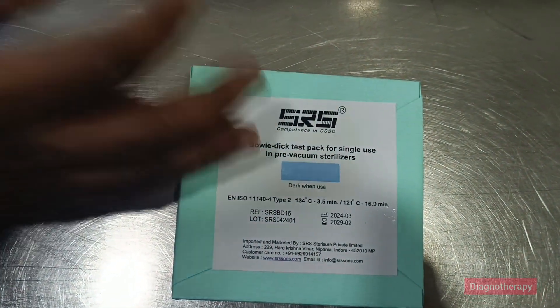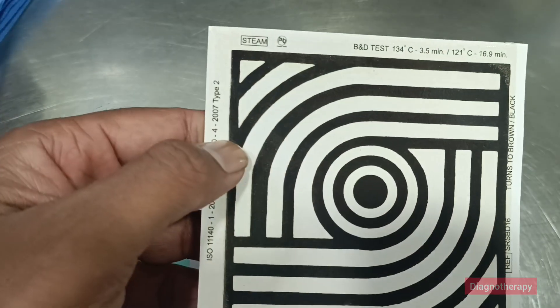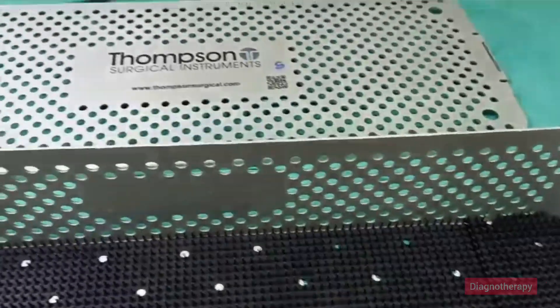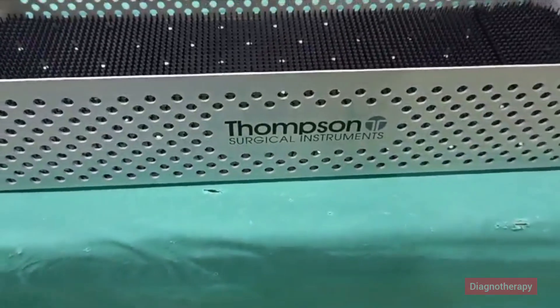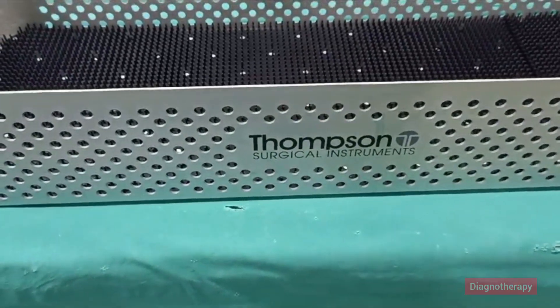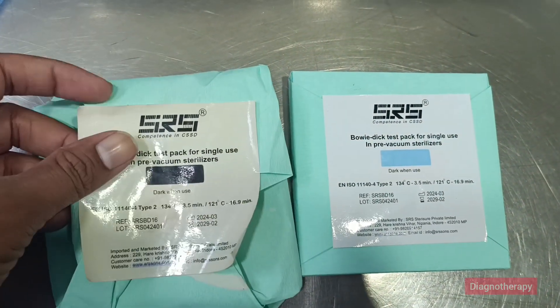The test packs contain thermographic paper. You can see in the paper there is a color change — the color changes to black when steam penetrates. A uniform dark black color indicates a successful test, while a partial or no color change indicates a failure.